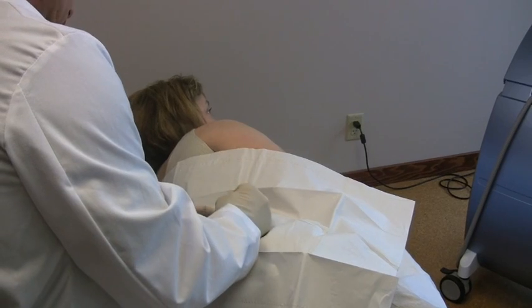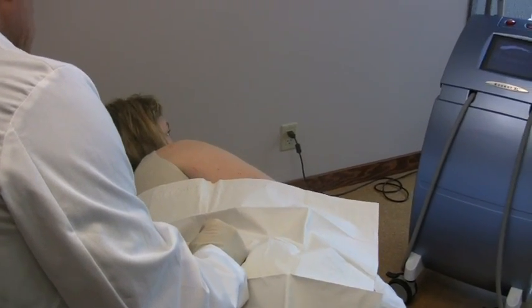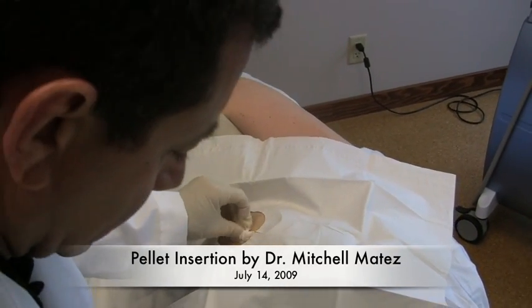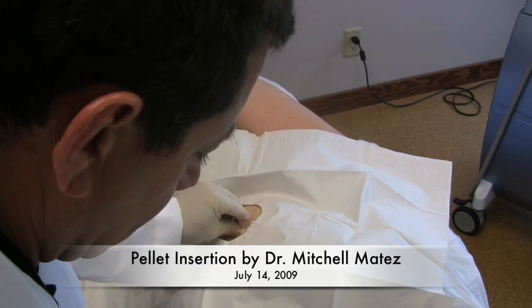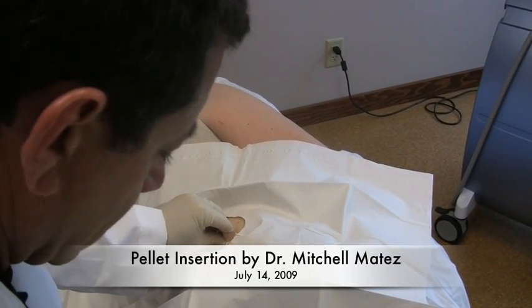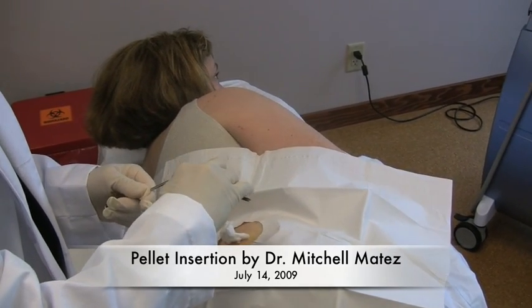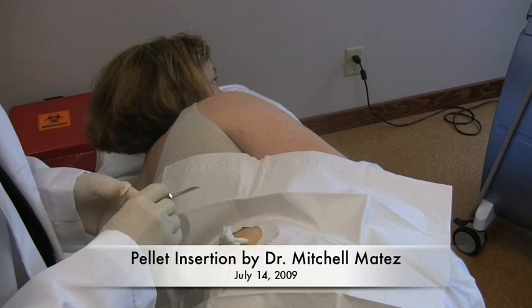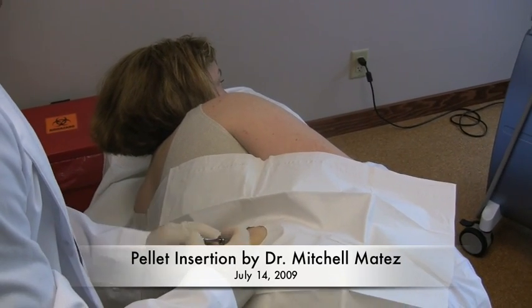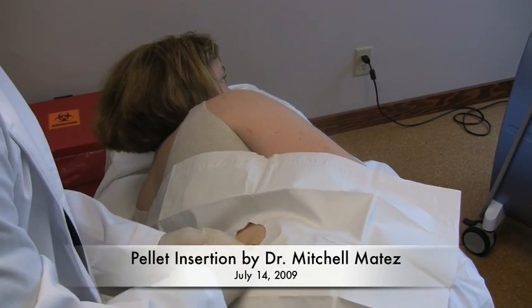Okay, now we're going to go ahead and work. If you feel anything unpleasant, you tell me. Do you feel anything sharp right now? No, not a thing. And for you folks watching here, we've made a very, very tiny incision — probably about a millimeter or so. You're going to feel a little pressure now, somewhat like I'm poking something into you, and that will not be entirely coincidental.